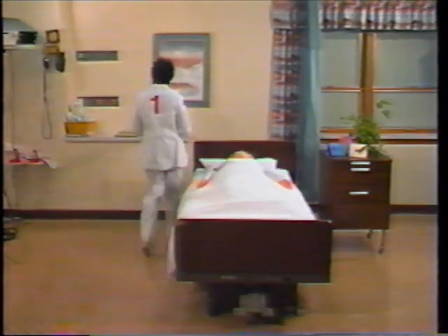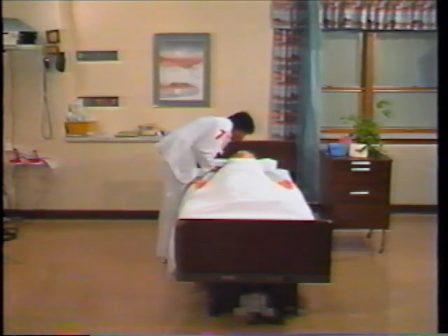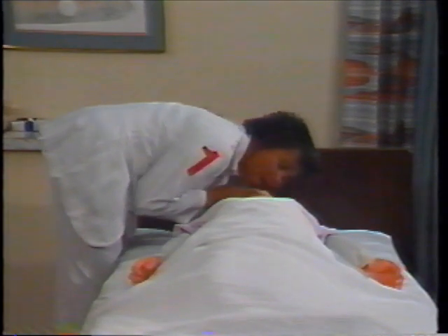You will notice that Resusci Annie has been placed in the room prior to the mock code. The code begins when nurse number 1 enters the room and finds her patient, Miss Jones, unresponsive. Since she's alone, she calls for help and pushes the emergency button. She opens the patient's airway and assesses breathing by listening, looking, and feeling. She immediately gives 2 full ventilations and palpates the carotid artery, establishing no pulse.